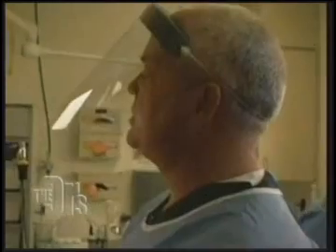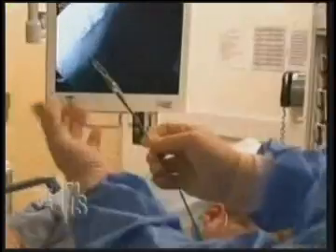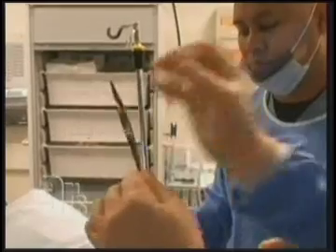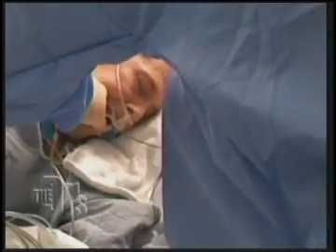And we're ready to insert the Bravo chip. If you notice, the Bravo chip is this little metallic thing right here. That's the dispenser. That's basically what shoots it out, dislodges it, and then it hooks into the patient's esophagus. So we're going to do this blindly, which means that we don't look at it through a scope. Swallow. Perfect. All right, so it's gone down.